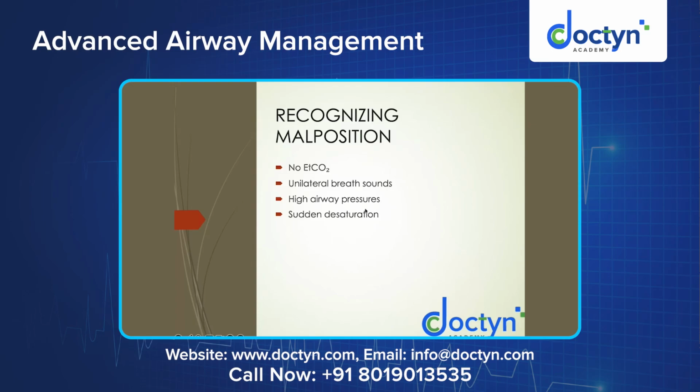Sudden desaturation. If the tube is slightly out, the cuff is not inflated well, there is an air leak. So that's why the ventilation is inadequate. This would lead to desaturation. Or unilateral breath sounds, as I said, if the tube is too far in, on one side there will be no air entry. That also confirms that there is malposition.